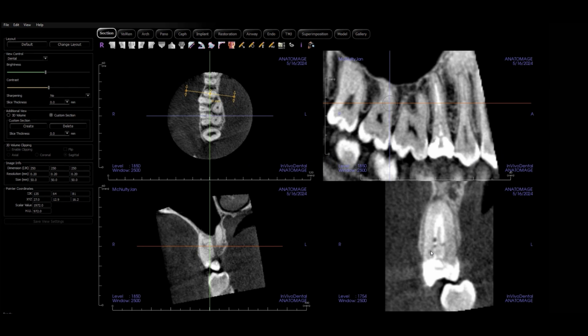We now know that that's not how to obturate teeth. I'm amazed that schools still teach it. It has no benefit. It has high risks. So placing the amount of sealer that we need for an antiquated obturation method, I think we're missing the point. So place as much sealer as you want, but then pull out 95% of it. So really what you want left is what's coated on the walls. So what I would say is place your sealer in both canals and then use a pack of paper points in each canal to pull out as much sealer as you can.